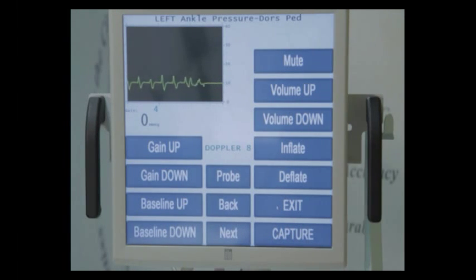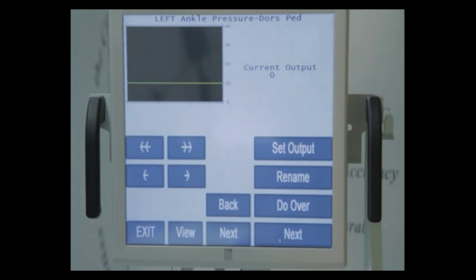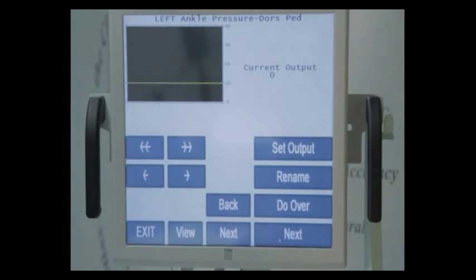If you have a situation that you're not able to obtain a pressure, simply press the capture button, and this will bring up your edit screen. What you can do here is you can set the output button. The output button allows you to manually enter a value that will be seen by the reading physician.